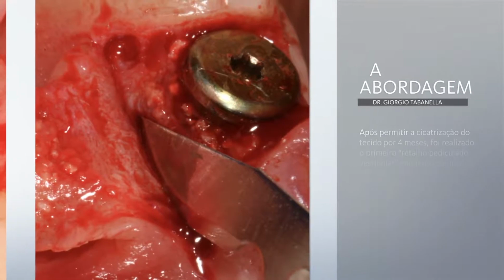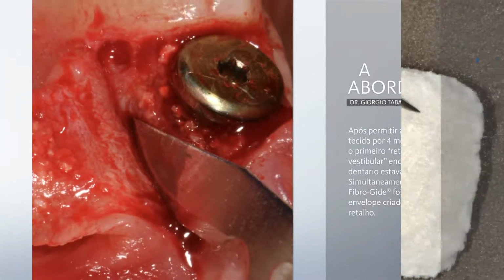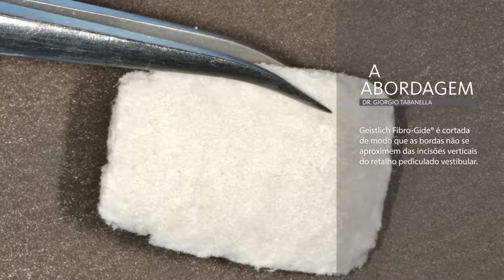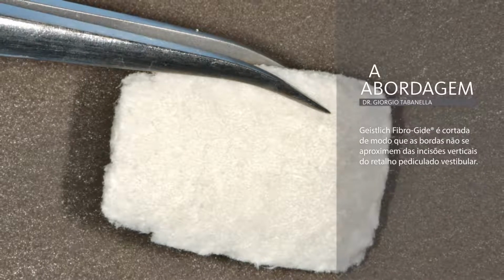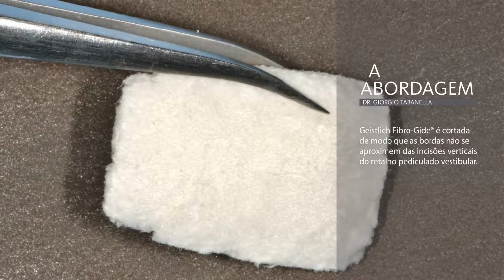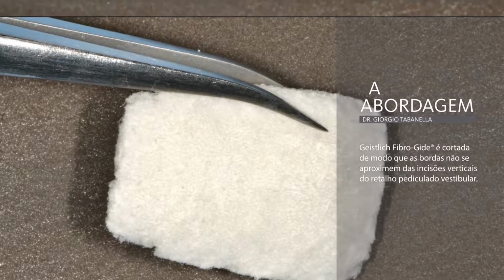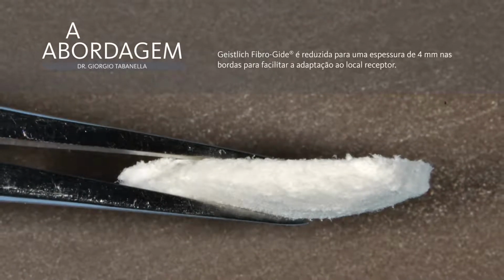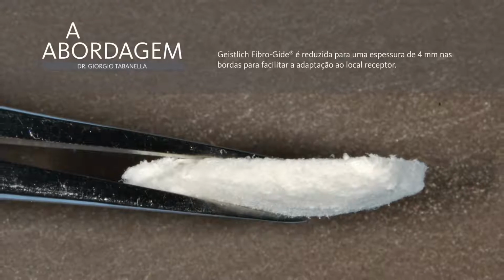At the time of uncovery, after 4 months, I'm going to perform the buccal pedicle flap. And also, I'm going to use simultaneously the Fibro-Gide. The Fibro-Gide will be trimmed towards its border so that the border itself will not approach the vertical incision of the buccal pedicle flap. This is a tricky part of all the procedures. Generally, I don't reduce the thickness of the Fibro-Gide except for, again, just the border.